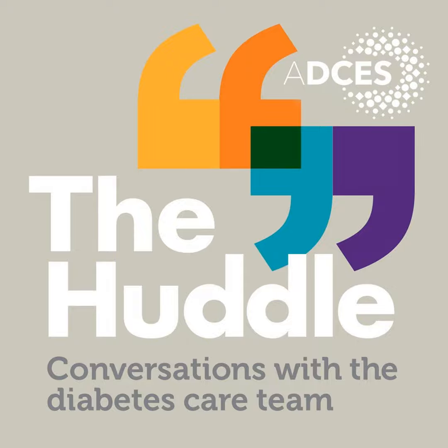Yeah, sure. So, CGM device selection is important and it really should be individualized since we have 4 different options to choose from. For someone that's brand new to CGM, I have them start off by wearing a professional device. That way they can see what it's like having alerts and get that experience to make sure that they definitely want to go forward and have their own personal CGM. So we do these professional CGM as shared appointments. And what's nice about that is they get peer support from the other people in the class.